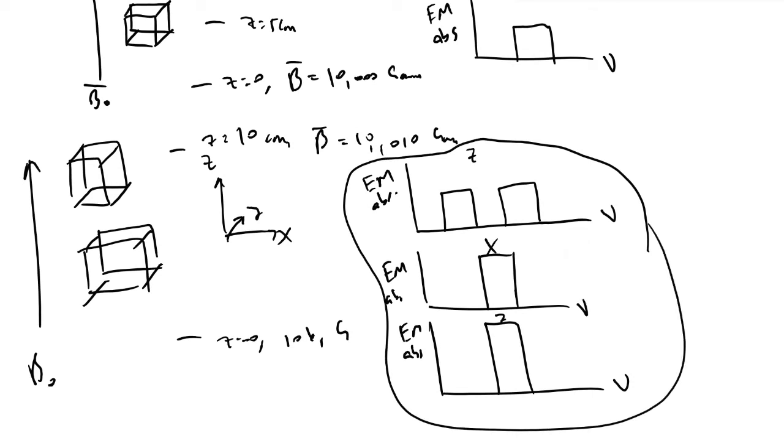And so based off this information, we have computers run a bunch of algorithms and stitch all this data together, and they're able to generate these three-dimensional data figures that have slices of brain tissue, for instance. And this is extremely useful to doctors who are interested in determining if patients have tumors. The main thing that we're interested in is the presence of water. So water is probably one of the most abundant proton sources for these kinds of spectra that we're generating. And so that's where we're getting all of our data to generate these kinds of spectra.